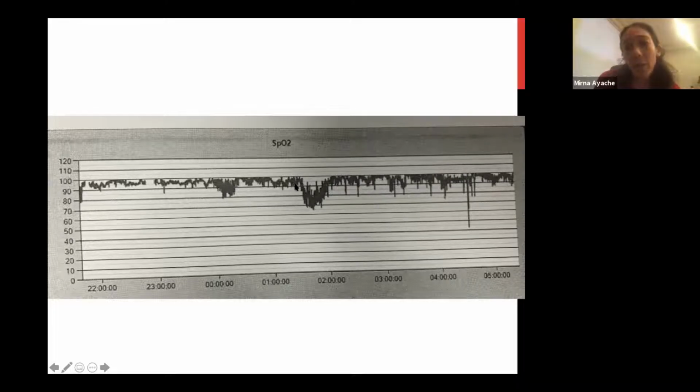Yes, you're absolutely right. Sometimes in REM, you can see the whole oxygen saturation baseline going down, and that can happen if you're having back-to-back events where there is not enough time for recovery. That could be just all sleep apnea, or there could in addition be some hypoventilation going on, or some desaturation due to cardiopulmonary disease leading to the whole baseline oxygen saturation going down. So you cannot tell for sure, but that's absolutely correct.